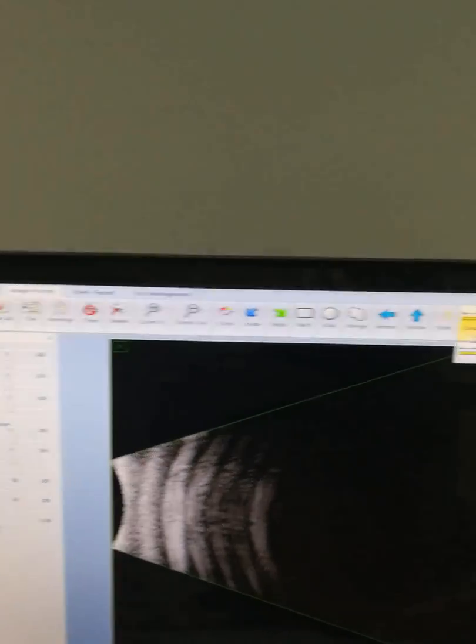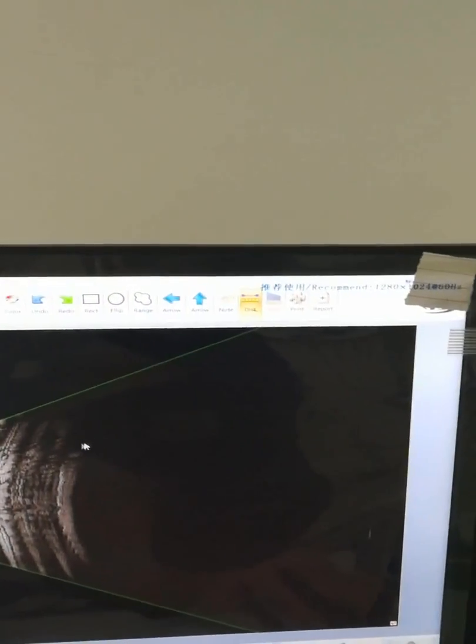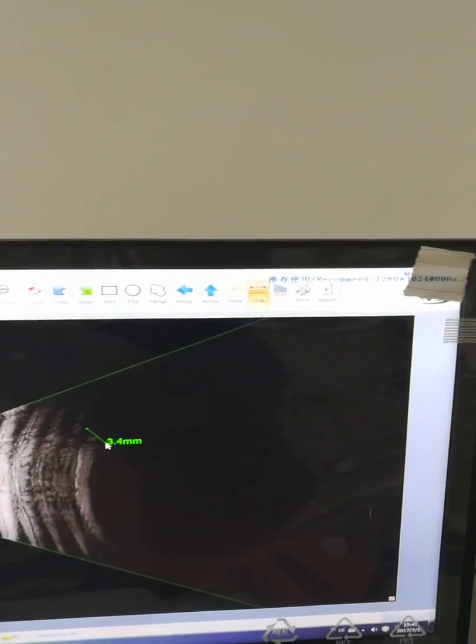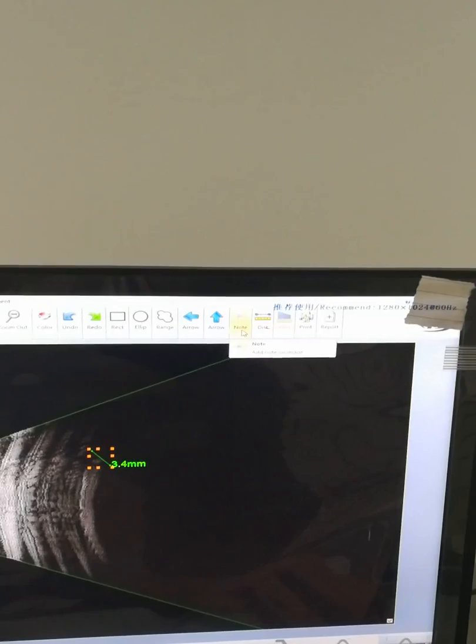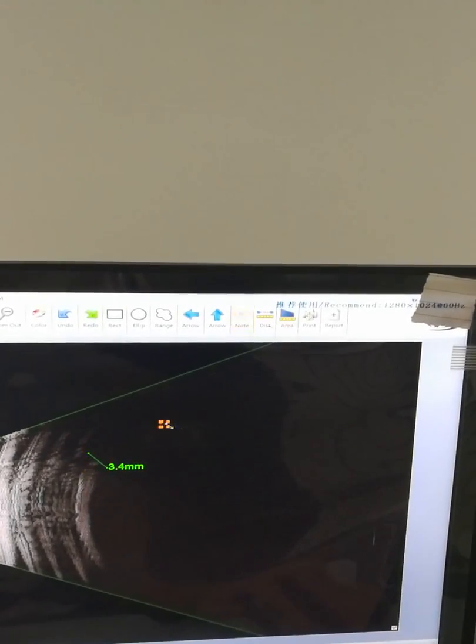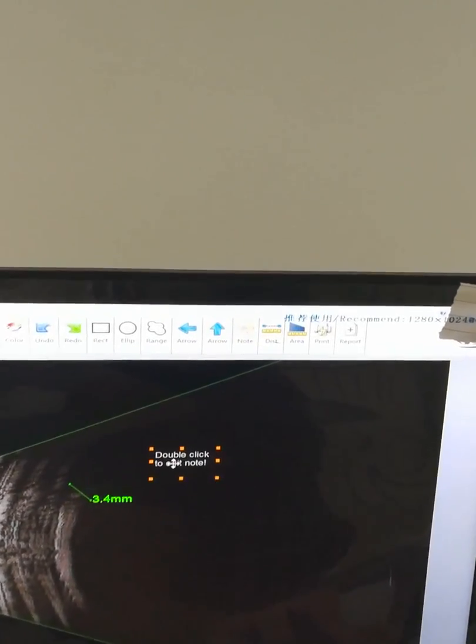You can also measure distance and make some notes here.